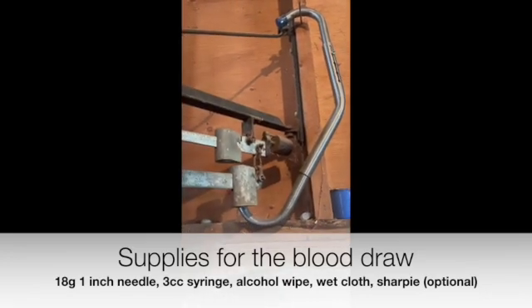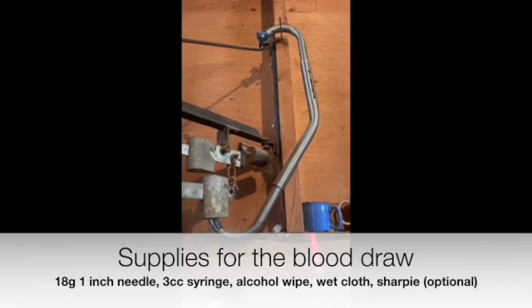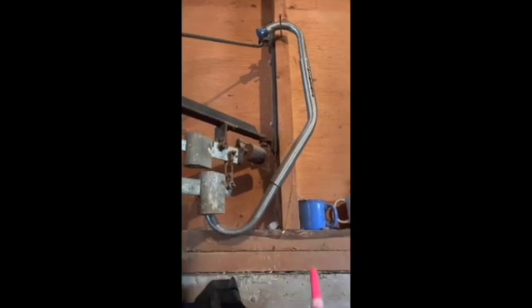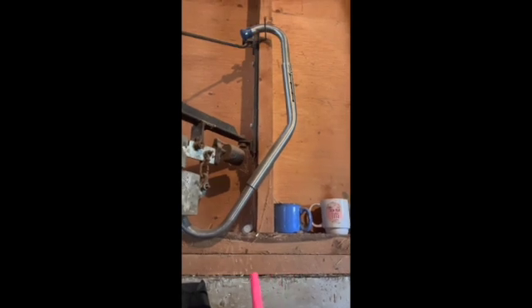I've got alcohol wipes and a 3cc or 3ml syringe as well as an 18-gauge needle that's one inch long. You want it to be at least a half inch long — actually a little bit more than half an inch, at least five-eighths or so. One inch is kind of my favorite to go with.